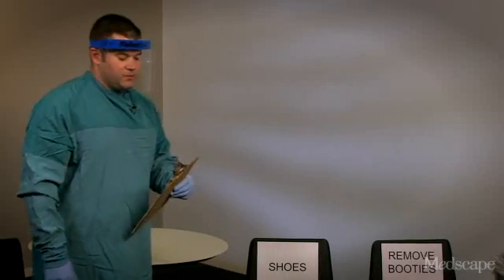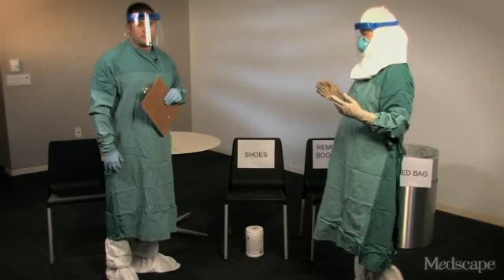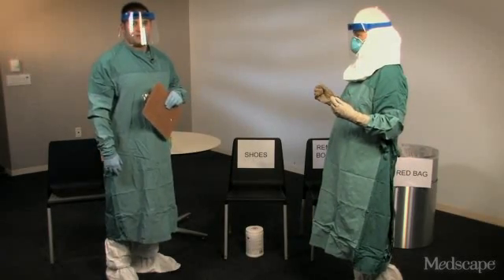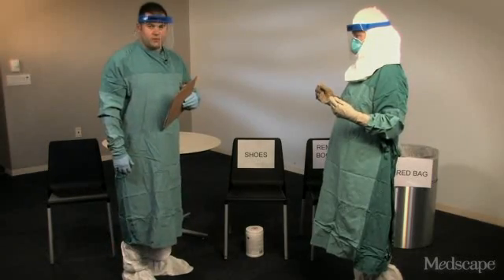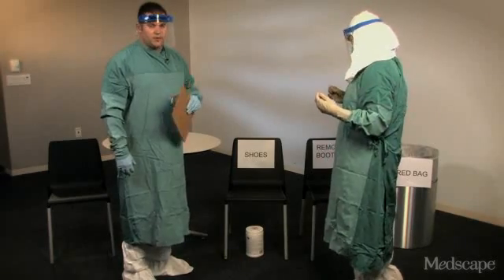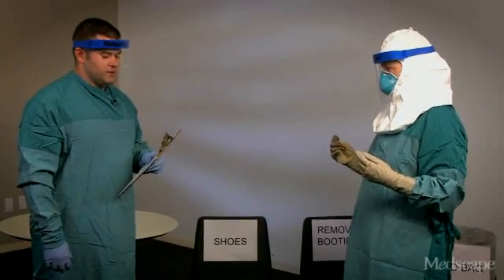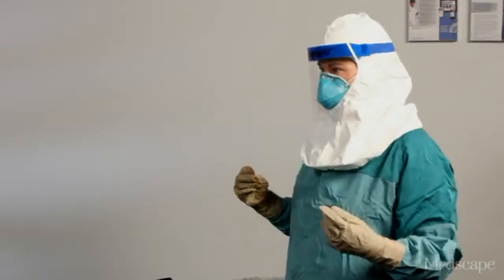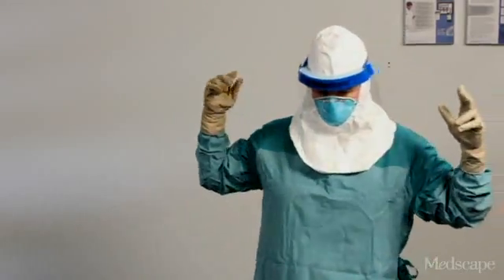Now let's pretend Barbara goes to see a patient. When she is done, we need to remove the PPE and make sure that she doesn't get exposed, which is the role of the trained observer to ensure this occurs safely and carefully. Now that Barbara is done providing patient care, her trained observer needs to be there to help her get the PPE off safely and discard it in an appropriate waste container. Barbara is first going to turn around and I'm going to inspect the PPE to see if it has visible contamination, cuts, or tears. While I'm doing this, I'm at a safe distance from her. And everything looks fine.